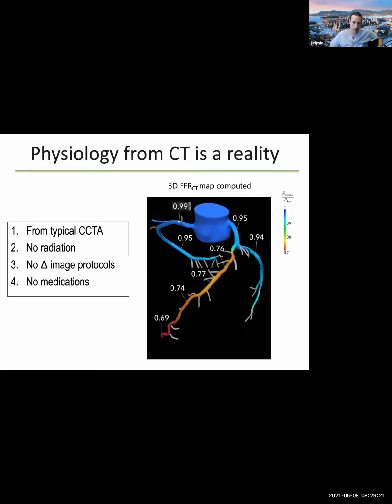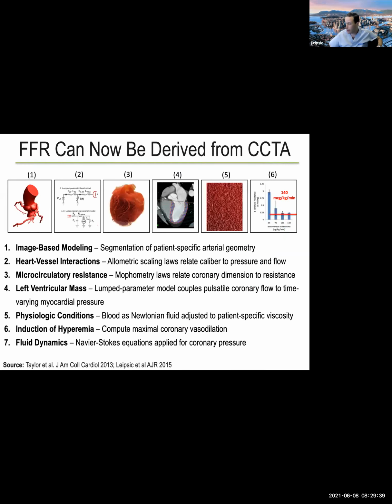And so again, about a decade ago, I was exposed to this concept of extracting the anatomical boundary conditions from CT and then applying computational fluid dynamics without a change in protocol, without medications, and without rescanning the patient. Now, clearly, I don't have time to delve deeply into the science behind it, but the field has really evolved over the last decade, and I'm sure you're working in many areas around AI, but the anatomical segmentation has become much more robust and much faster and reproducible through AI-based segmentation of the anatomy.